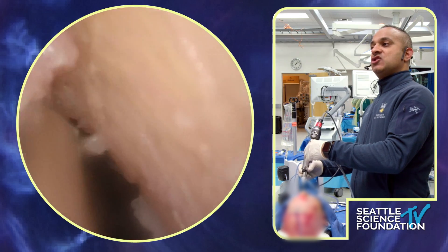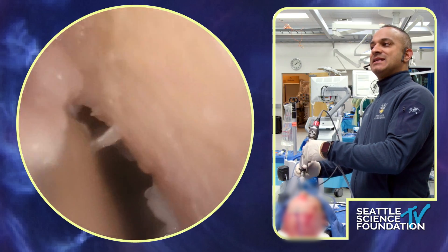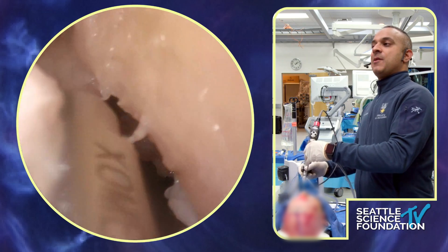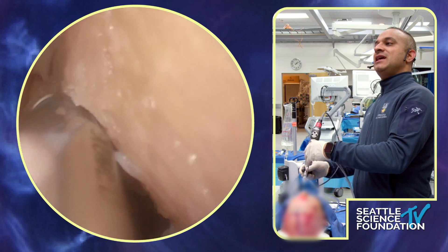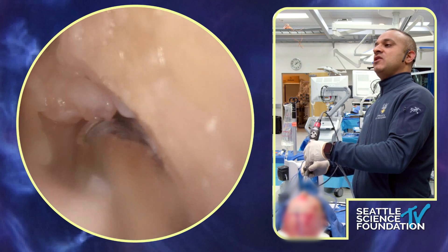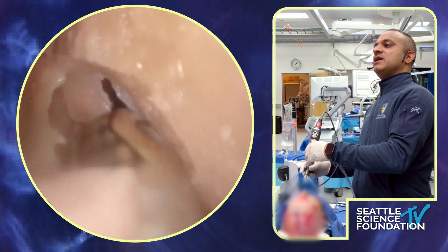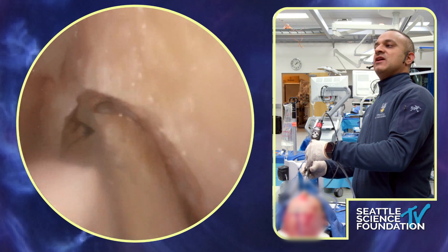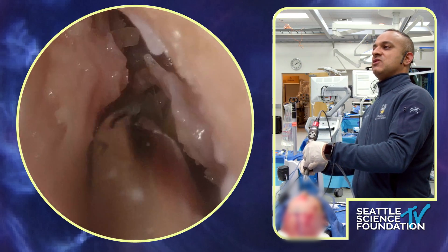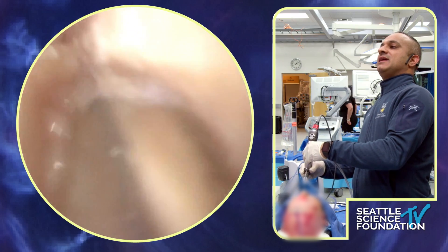What you can see is that same thing Nitin showed us about 2B — where you take a small sliver and leave the bottom part of the middle turbinate but attack the armpit of the middle turbinate — if you do that, you're now in a position to see this armpit and can very easily remove bone from here and see your frontal sinusotomy. This is the technique I mentioned about turning the microdebriter into a drill: if you have a small amount of drilling to do, you can do that easily with the microdebriter. I wouldn't recommend it for larger amounts of drilling since you can heat up the handpiece and create damage, but for creating a frontal sinusotomy like this it's an easy way to do it.